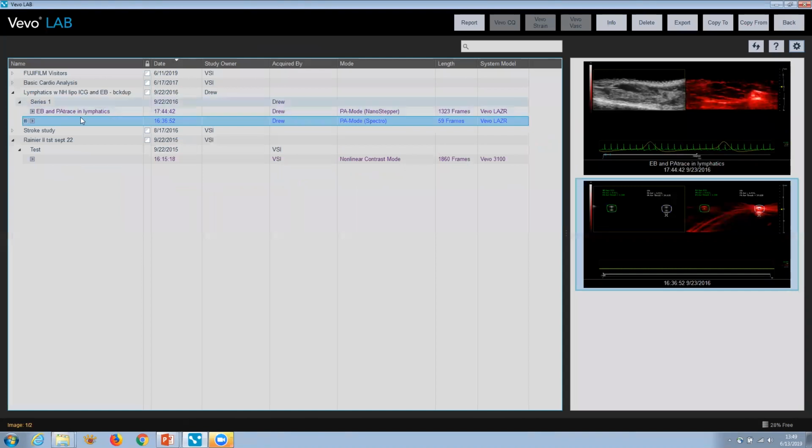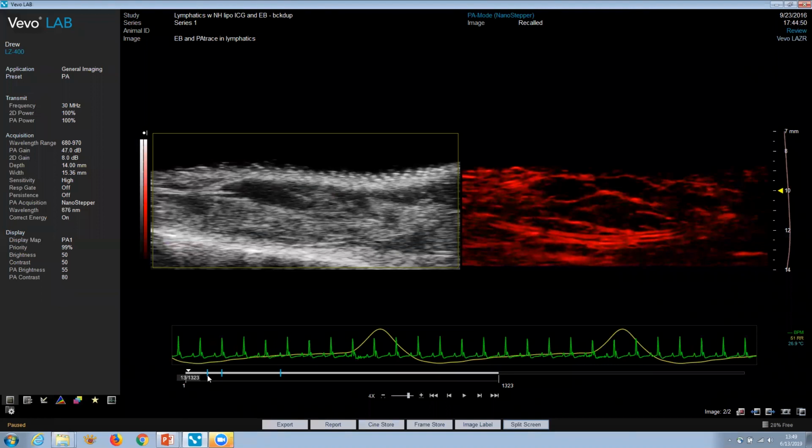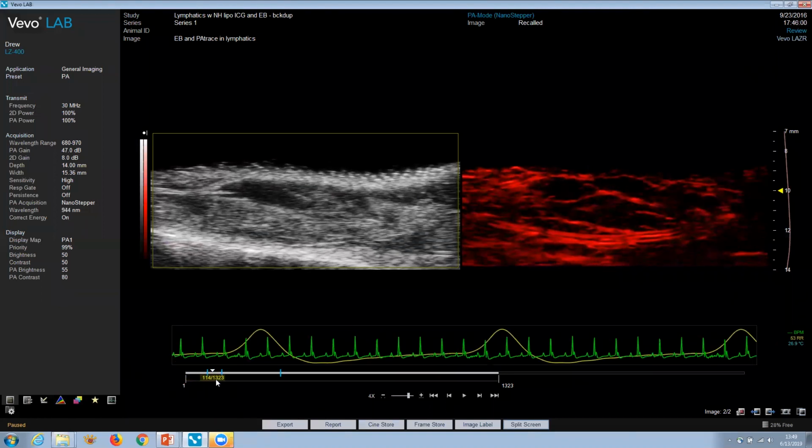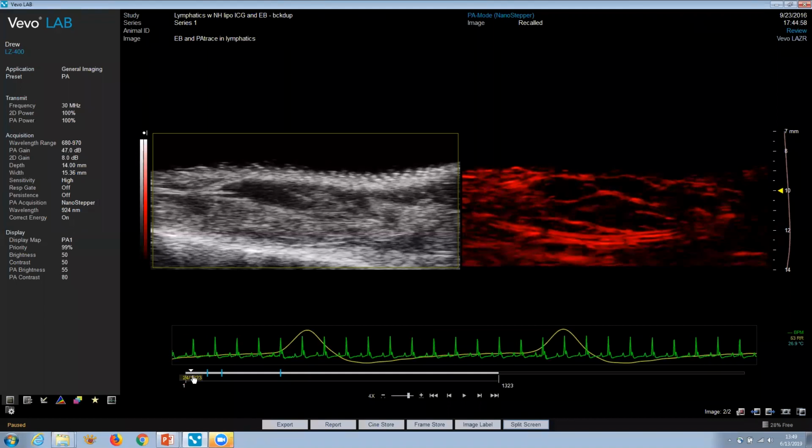So now I can go back into my multispectral acquisition. This is actually a neat study. Again, I won't go into great detail, but this is a neat study where we were doing a co-injection of these 2 dyes into the foot pad of a mouse and watching perfusion through the lymphatics. So I can then go into my spectral unmixing tab down here.